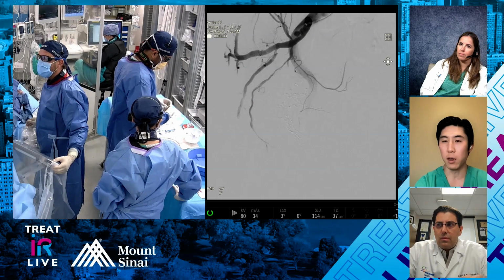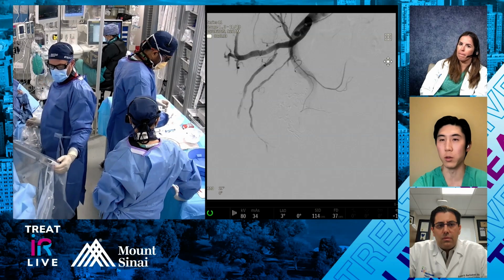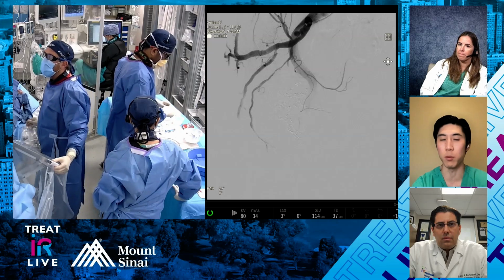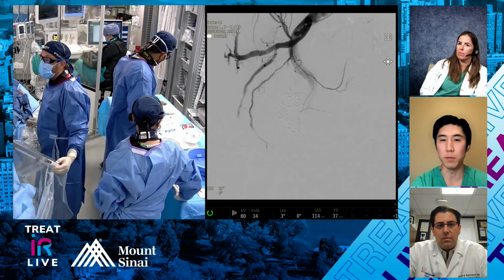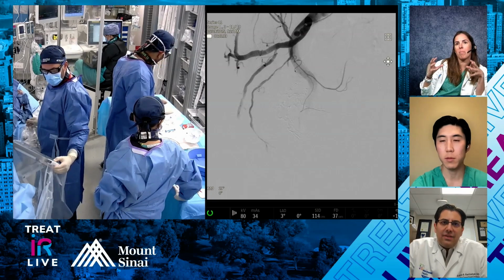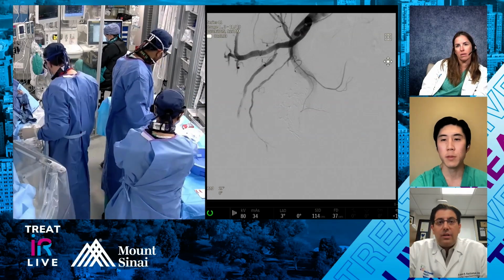And that's why I think a lot of us tend to use a little bit more of a dilute glue concentration versus overseas, where they use a much more concentrated glue concentration. So that's just something to consider when people are looking at some of these references online, that the glue compounds can be different. Everybody keeps talking about penetration and getting deeper into the gland. Why is this important? Because we have a score.